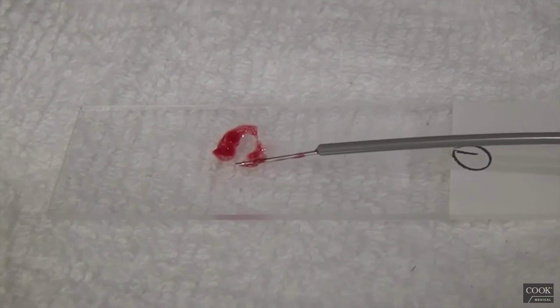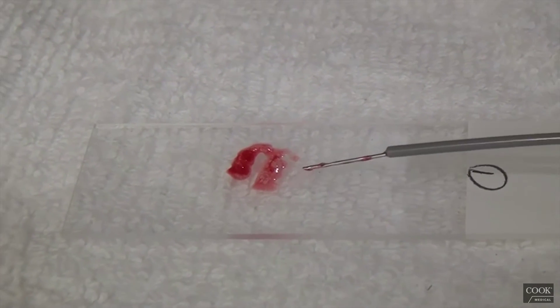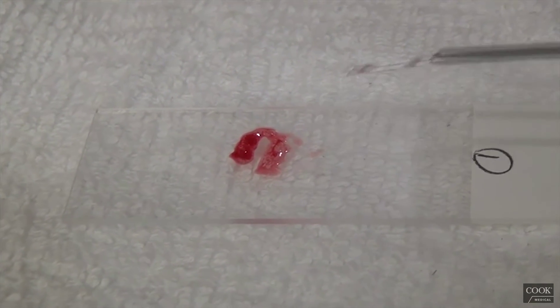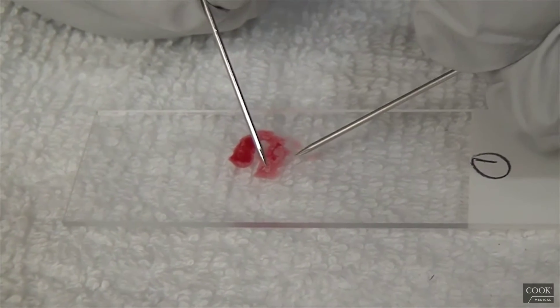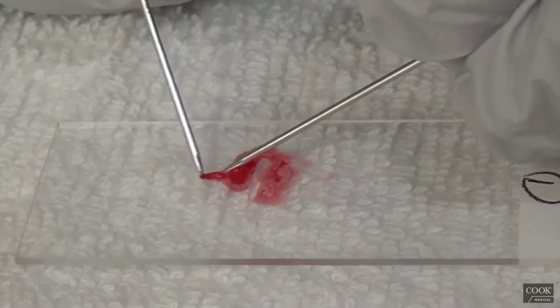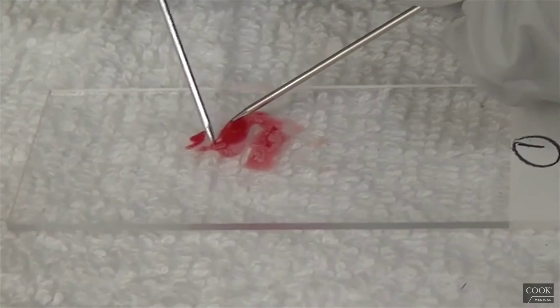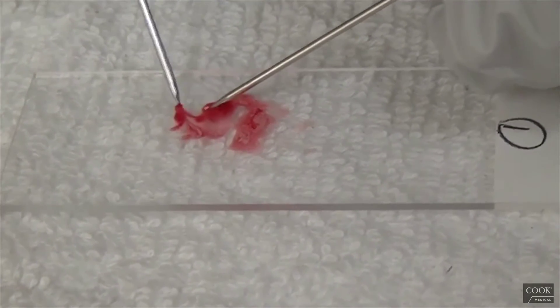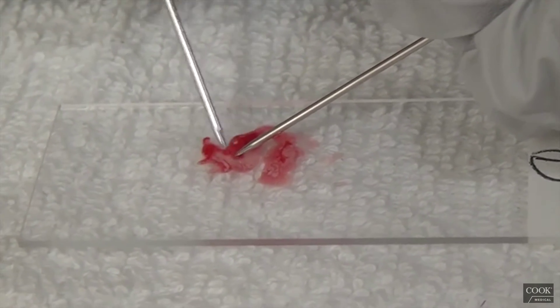Look at that — amazing core. This is great. What you see here is all of this is actually micro-core, a little bit of blood. And here is actual core. Here's core. This is a long piece of core right here. Can you see that? And that's core.